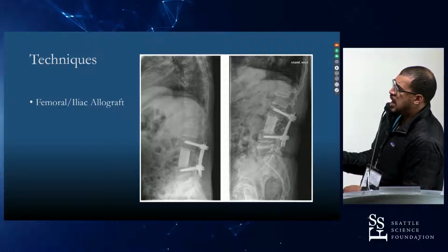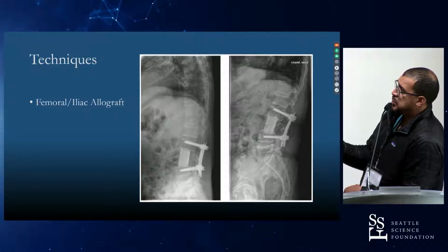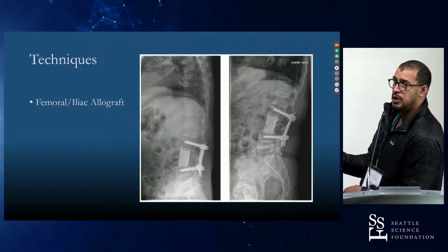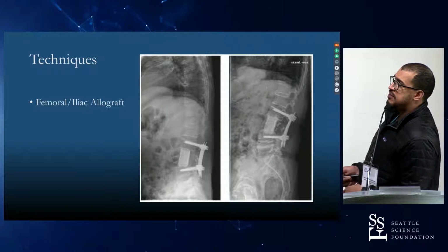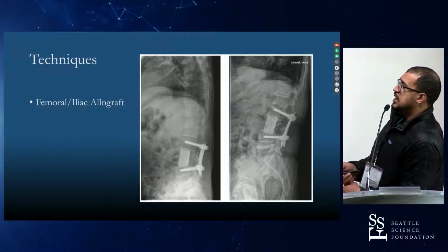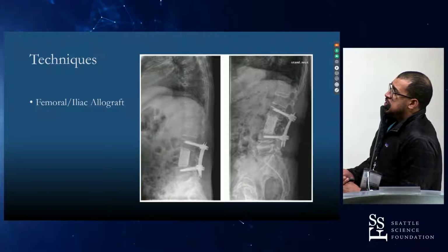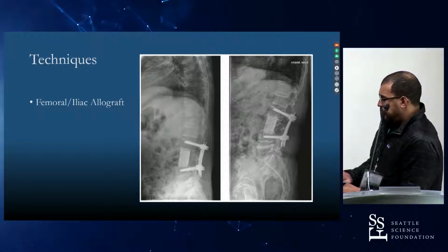We wonder about how rigid this construct is with the minimally invasive posterior and just one level above and below. Sometimes that fixation is not robust enough to last. This is probably going to look good in the short term, but may not be as durable of a construct in longer term.